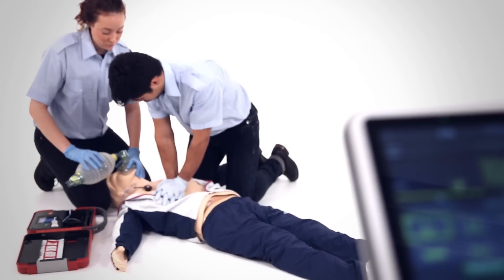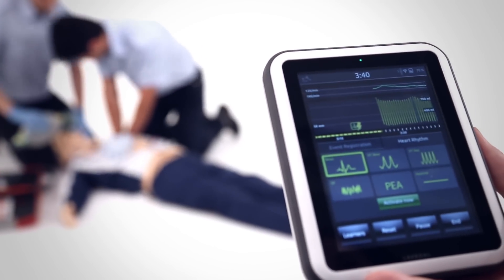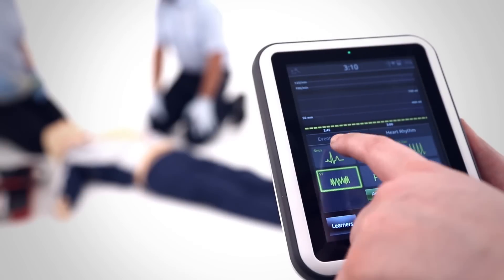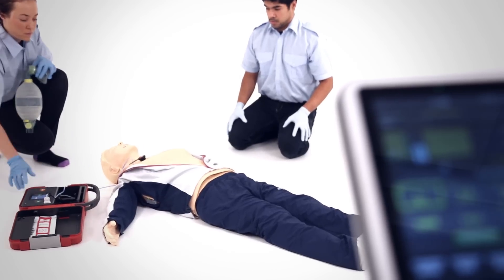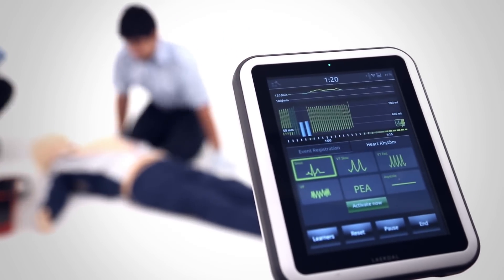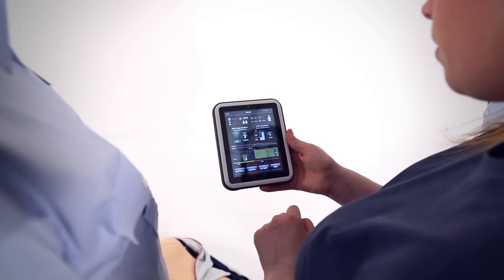Using Sympad's Skill Reporter in conjunction with the Reisussian QCPRD manikin, you can change the heart rhythm on the manikin. The defibrillator recognises different heart rhythms and recommends shock when detecting a shockable rhythm. All events are registered in the timeline.